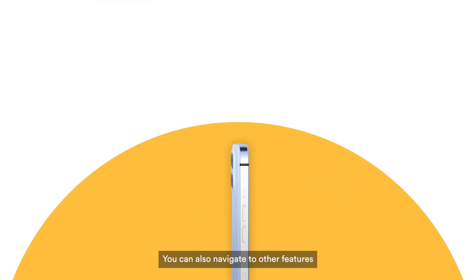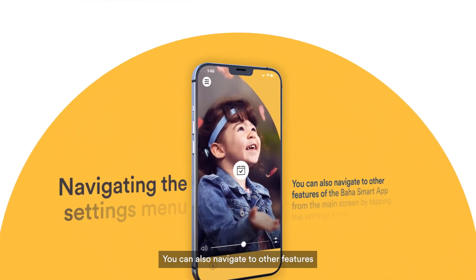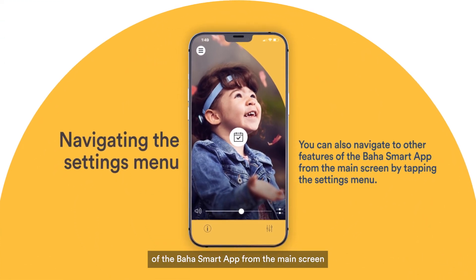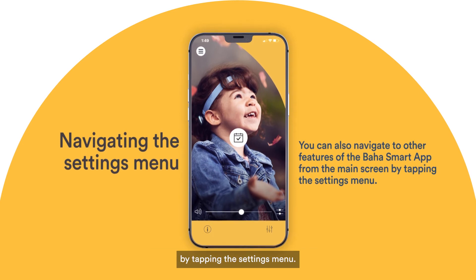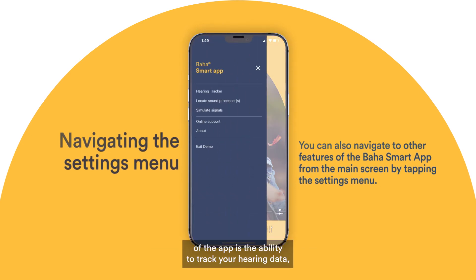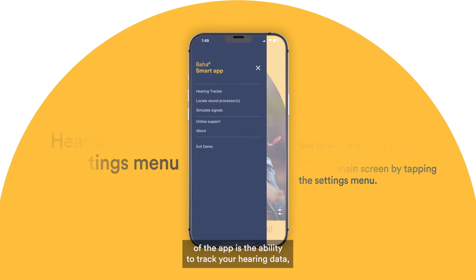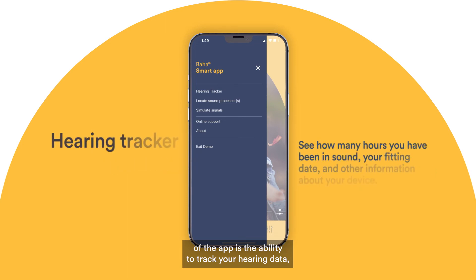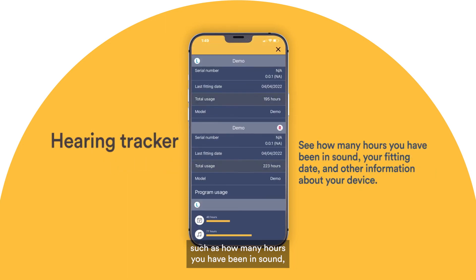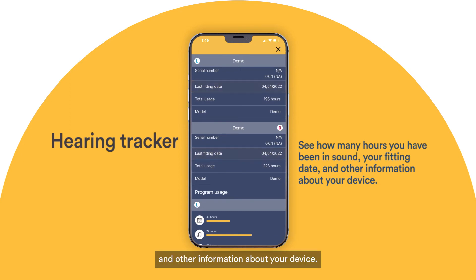You can also navigate to other features of the Baha Smart app from the main screen by tapping the settings menu. One of the features of the app is the ability to track your hearing data, such as how many hours you have been in sound, your fitting date, and other information about your device.